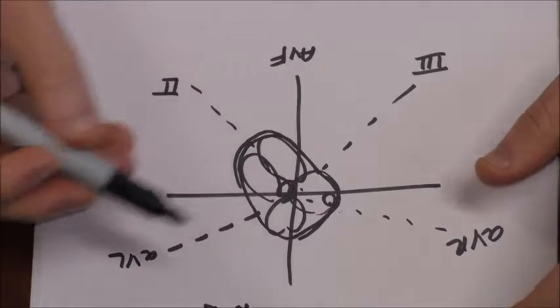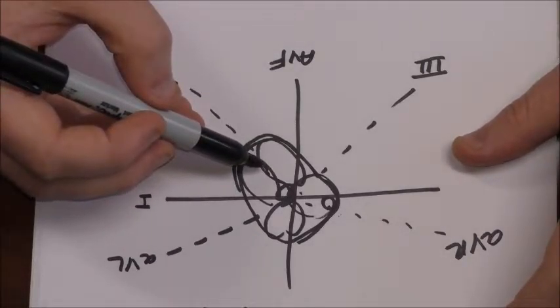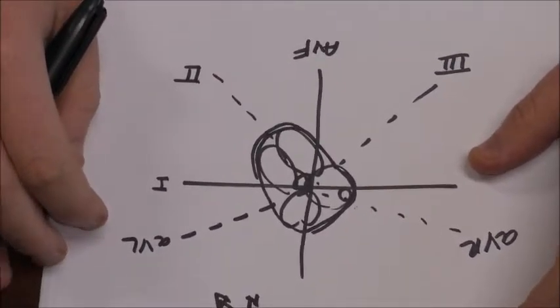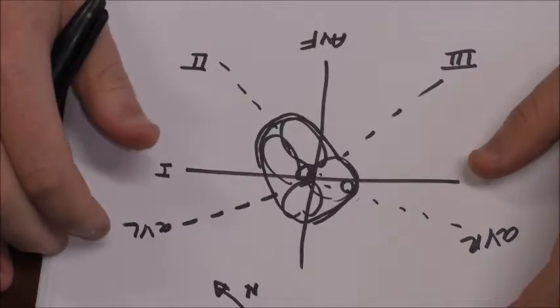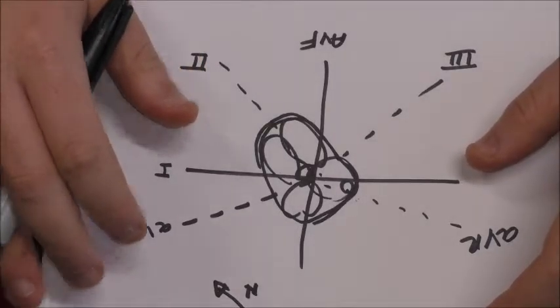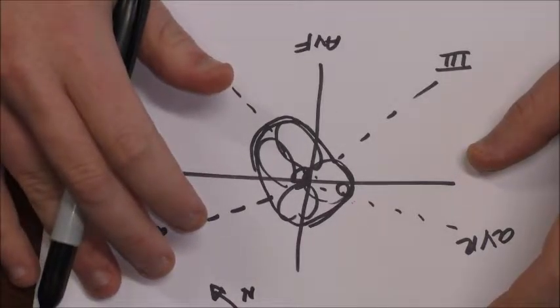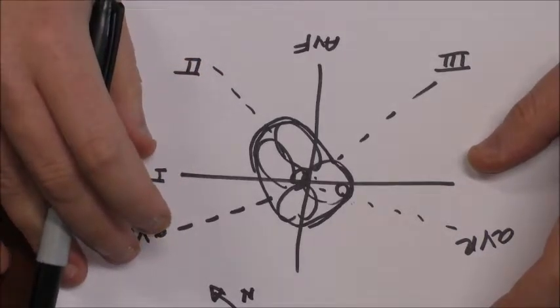So it would make sense then that most common teaching is that, when you first look at an EKG, and everyone has their different techniques of reading EKGs, a lot of people will say rate. Okay, so rate is the first step, and we'll be able to go over that. Rhythm is another step, and that's another thing we can go over, but axis is a big thing and probably something that people don't really understand all that well.